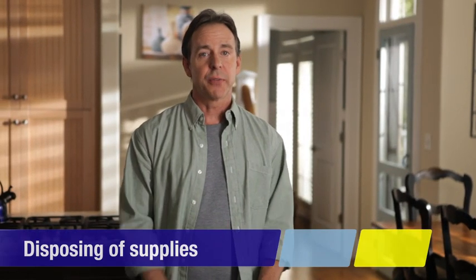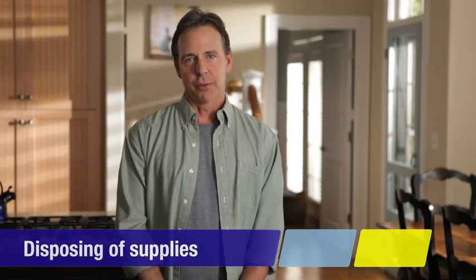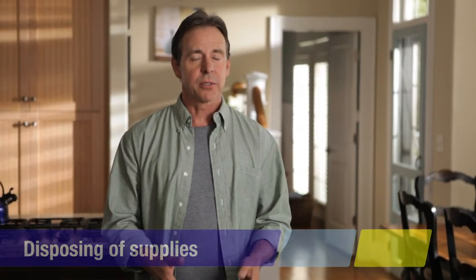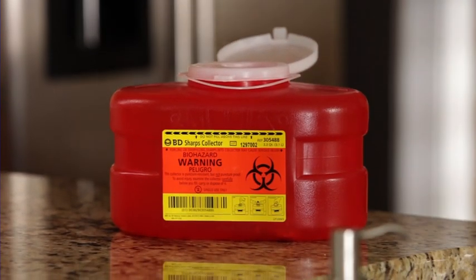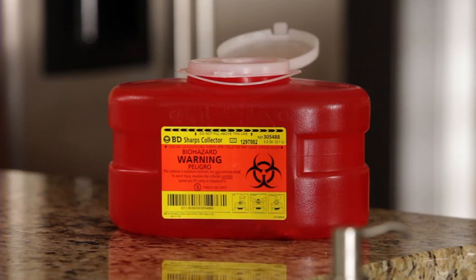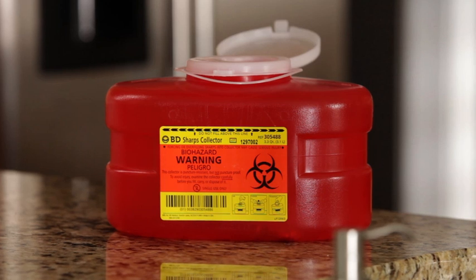Now you'll need to dispose of things safely. Do not reuse the pre-filled syringe. And to avoid needle sticks, never recap the needle. Just place the used pre-filled syringe in a closable, puncture-resistant container. You can use a red biohazard container called a Sharps container. These can usually be bought at a local pharmacy.